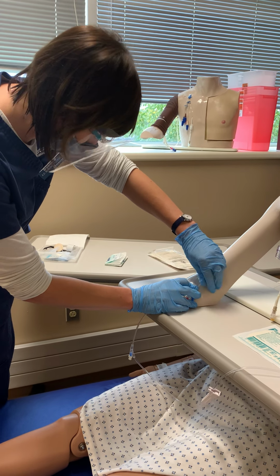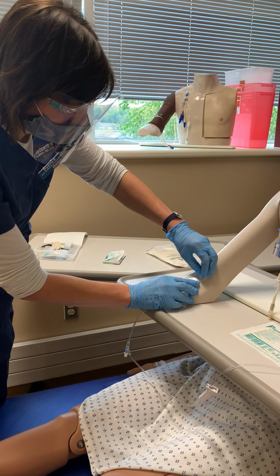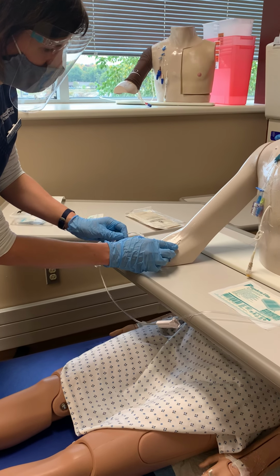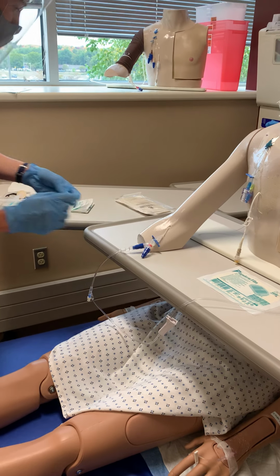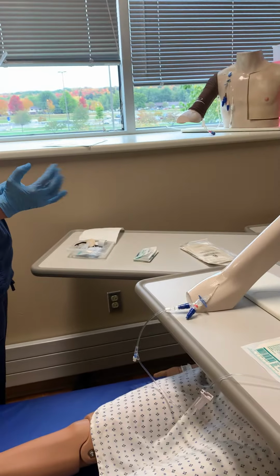Now I am peeling up so that I don't accidentally pull out my line. Okay, that's staying. Gravity's not fighting me like that.